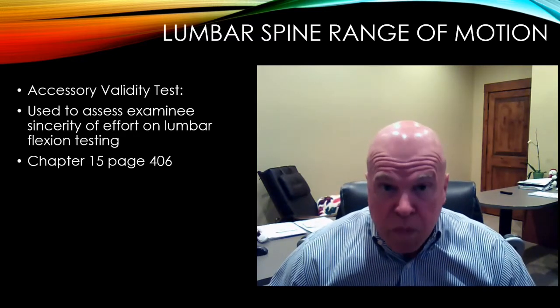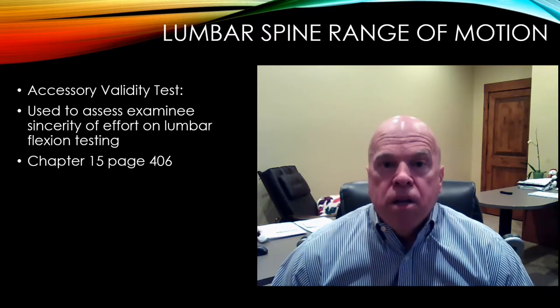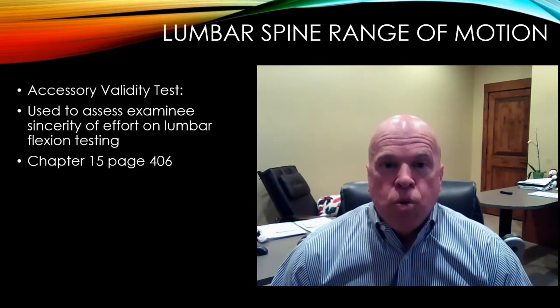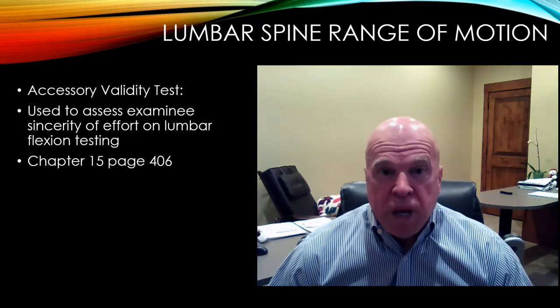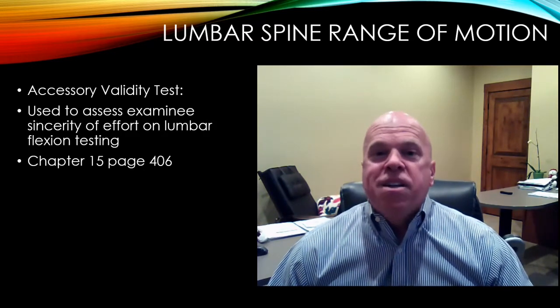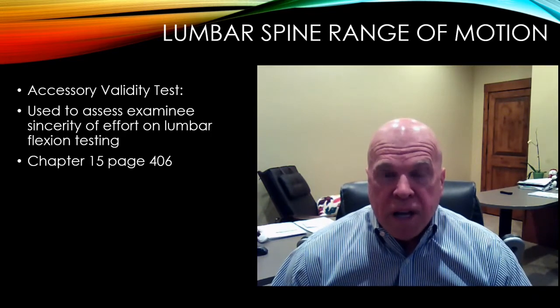So you must obtain inclinometers in order to do your spinal range of motion testing, and I recommend that you obtain dual digital inclinometers if you want to simplify your work and you want to be involved with this type of work for many years to come. It only makes sense that you must make a minimal investment in your future as a qualified medical evaluator to obtain the necessary instruments described by the AMA guides. So that's one comment I want to make about examination instruments.